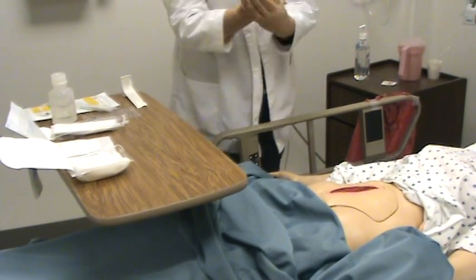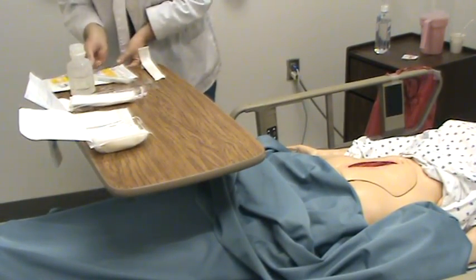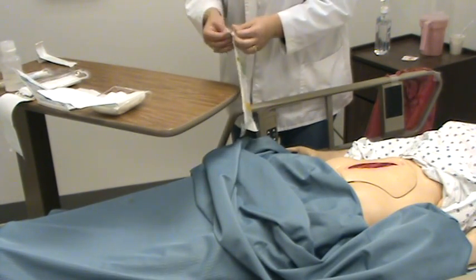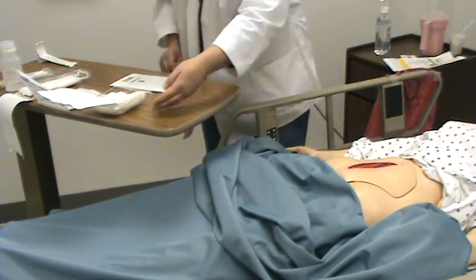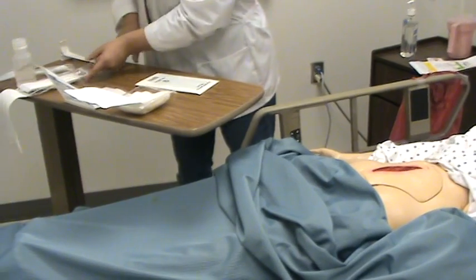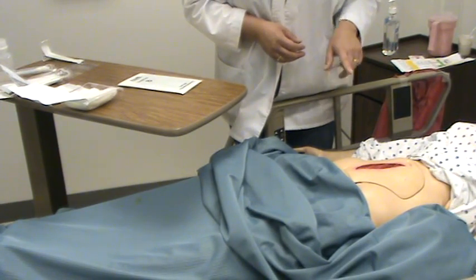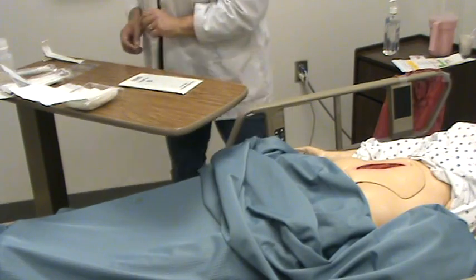Then I would go ahead and wash my hands. Now I want to get my sterile gloves on because I've got everything ready to go. I'm not going to go into a lot of detail with the sterile gloving because your Mosby did an excellent job on that. I'm going to move some of this over so I have room. You also want to make sure that you note the skin condition. I looked at the dressing to see what all was on it. A very big part is looking at the wound itself — you want to see if there's any type of redness or erythema around the site, and you want to check the depth also.